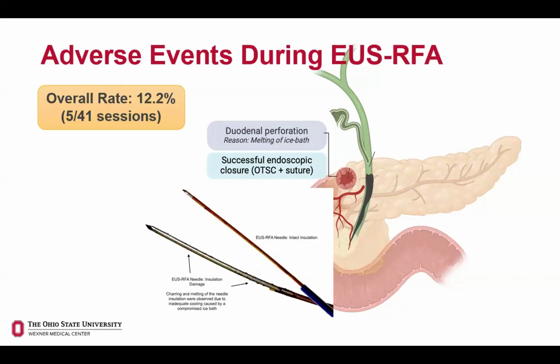We submitted an IRB amendment. It was a whole big exercise because you have to be obsessed about the ice bath, that you have intact ice. Almost get 2 ice baths, have one as a backup in case. The other important thing is that once the ice bath is in and starts circulating in the cooling jacket, always get a feel of it. You can feel the water circulating. If you don't feel the water circulating, it means something is kinked and the water is not flowing. So always be sure the water is circulating.